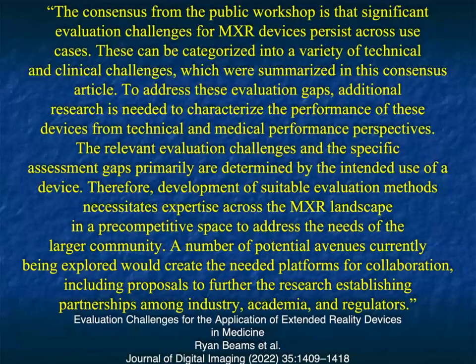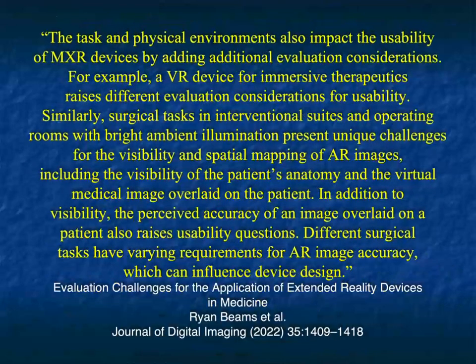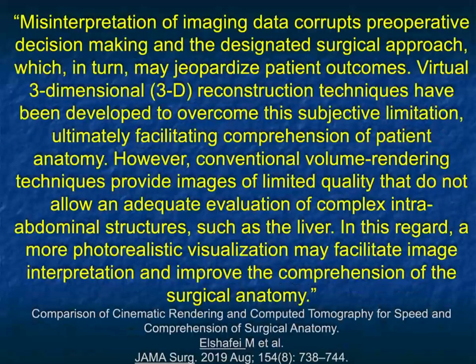Imagine something like augmented reality. But again, what happens in the gaming world, what happens outside of medicine, often will drive the speed of what happens in medicine. And again, we're going to have to see really where this fits in. Again, that article by Beams: different surgical tasks have varying requirements for AR image accuracy, which can influence device design. So I think it will take time and things will need to change, but I think it's something we need to get involved with now and really think about what we can possibly do.